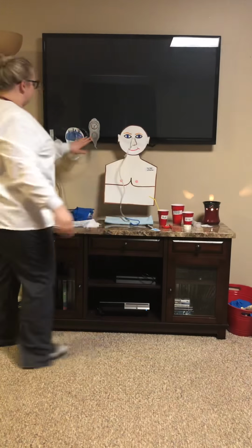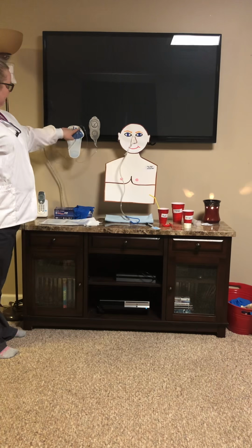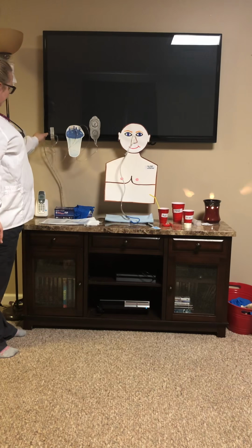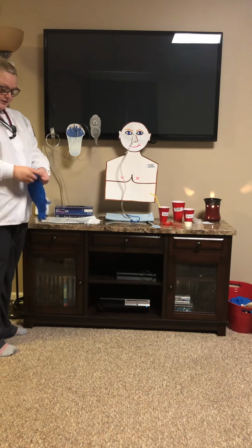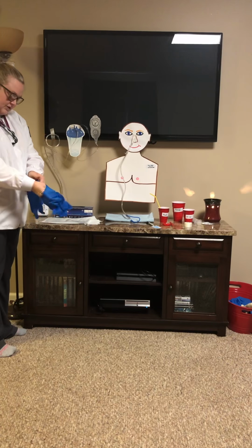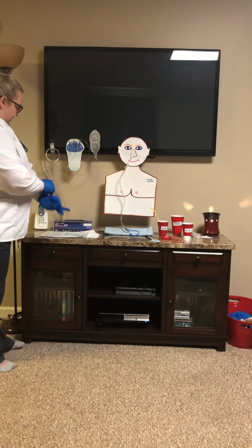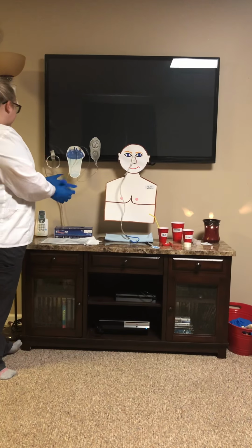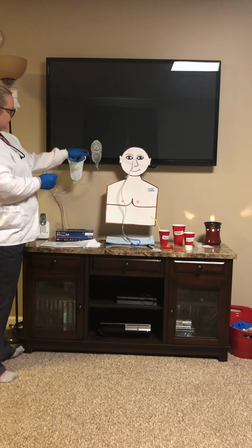I have wall suction here. I would change to intermittent, and it is connected from the suction to the canister, from the canister to the patient. I would apply clean gloves and explain to the patient why we suction and that the physician has ordered this. I would test the suction with a gloved hand. Since it's turned to intermittent, I want it to be between 20 and 40, and we are successful.